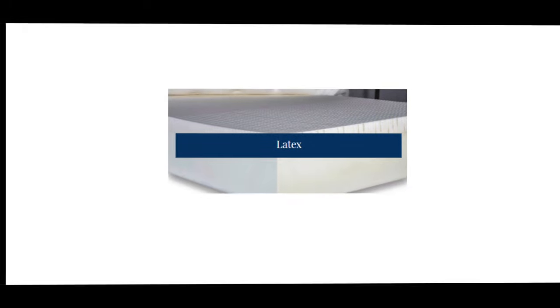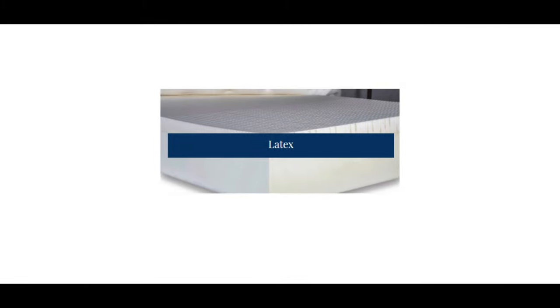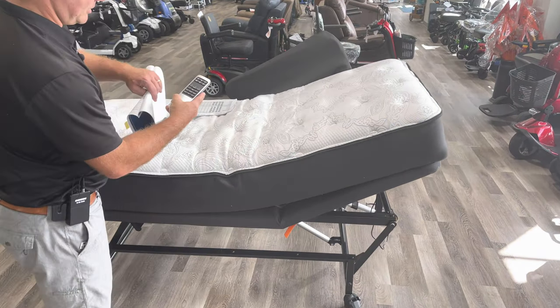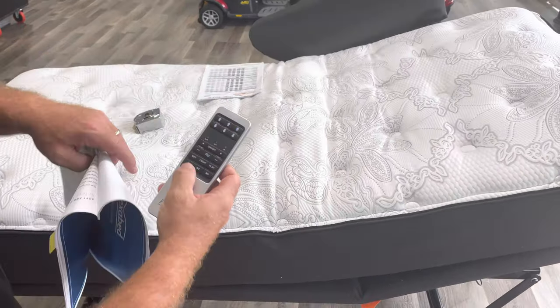You can also order a low profile mattress — the only reason you'd order that is if you really need it short. You can press it flat. You also have memory settings so you can set it at different positions and just press the button to return to them.